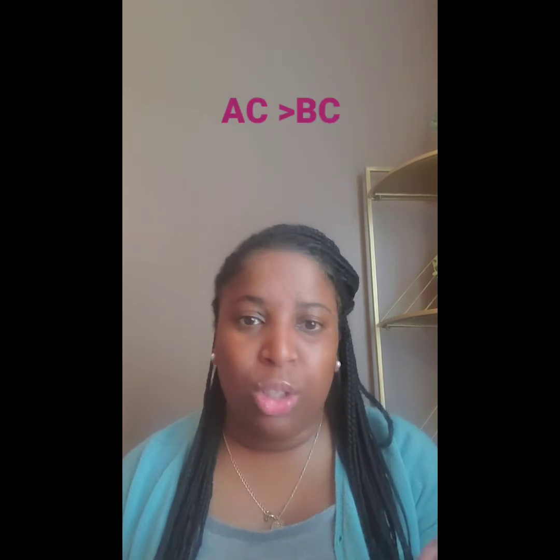Rinne test. So with the Rinne test, it's a little bit different, but the same concept. This is testing more for the conduction. So air conduction versus bone conduction. You will commonly see this as AC versus BC. The normal findings, AC should be greater than BC by a 2-to-1 ratio. So AC, your air conduction, should be greater than your bone conduction. So we're going to do, again, this is my fake tuning fork. You're going to hit your tuning fork, first placing it on the mastoid bone, because that's your bone conduction.